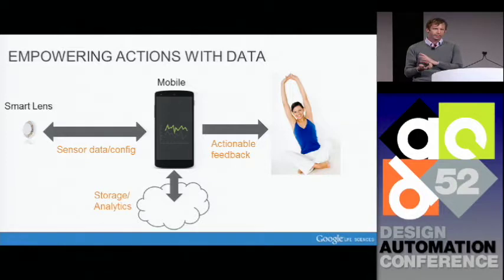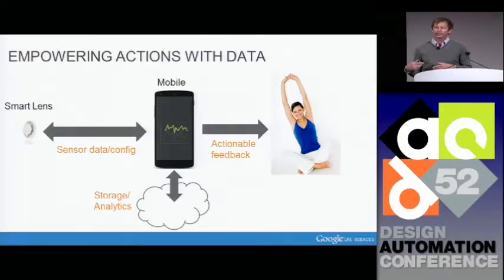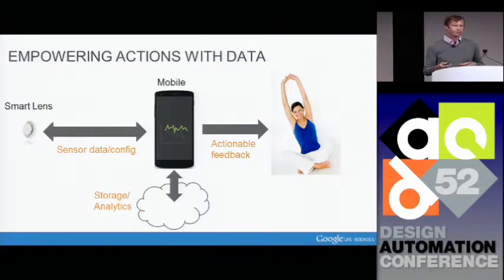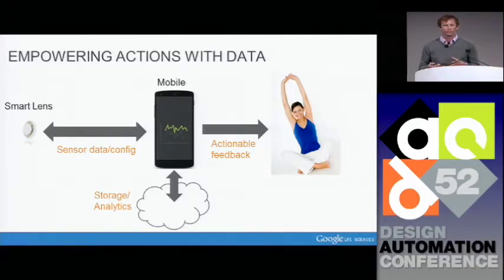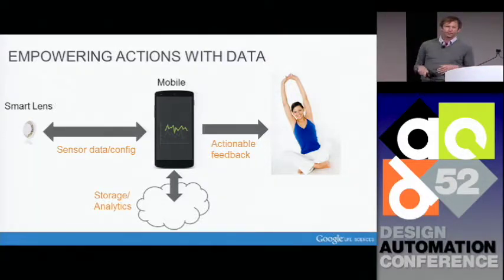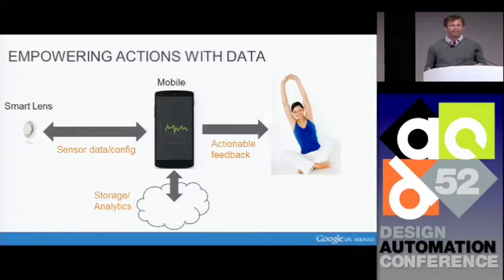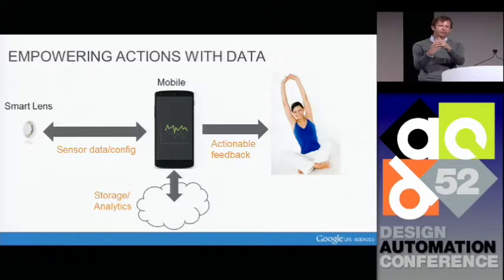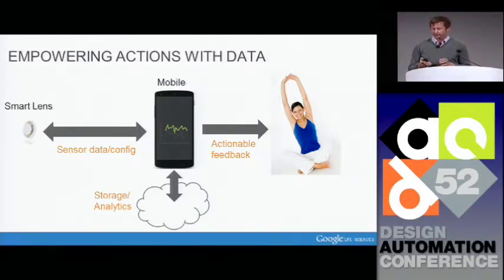Once it's there, you have a beautiful display to visualize the data. You have direct access to the cloud to do the HIPAA-compliant storage, all the analytics that are needed, and you have a good platform to provide actionable feedback back to the person who needs it. And this is a platform and concepts that are well underway in the diabetes technology community, fortunately. What we're trying to do is create new types of devices that can plug in to this platform, contribute as much as we can, because these technologies are extremely critical and urgent.